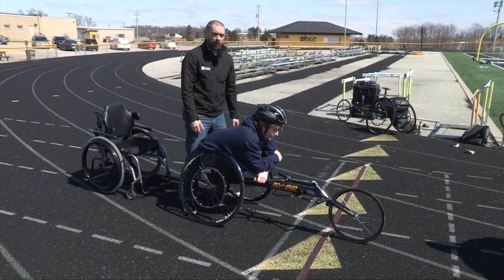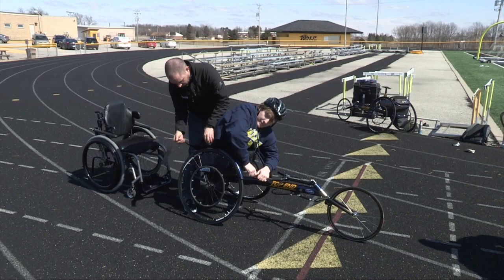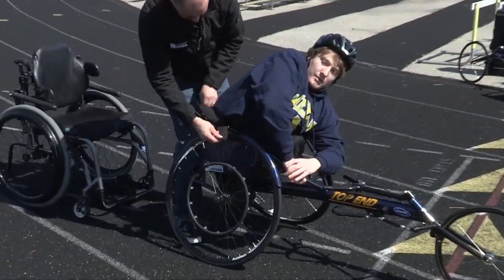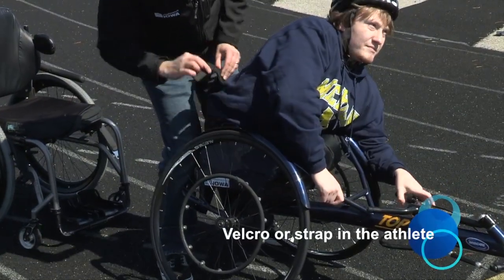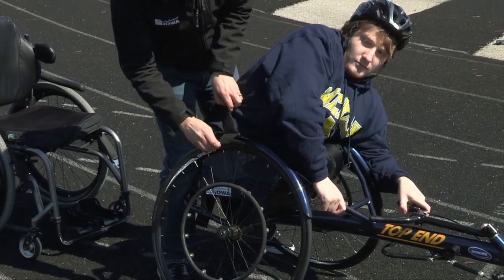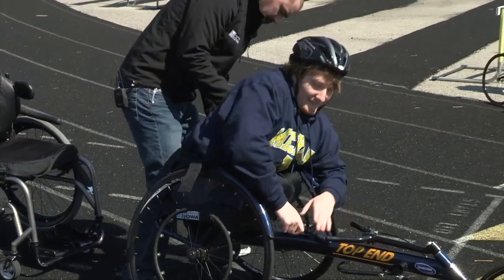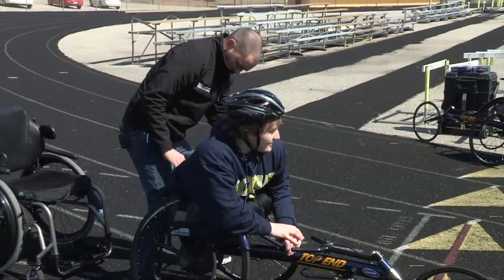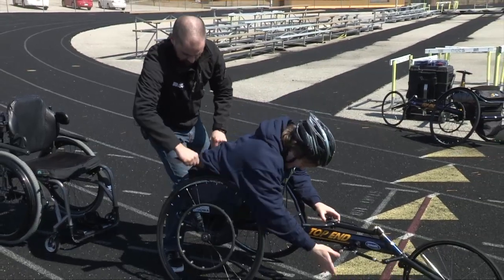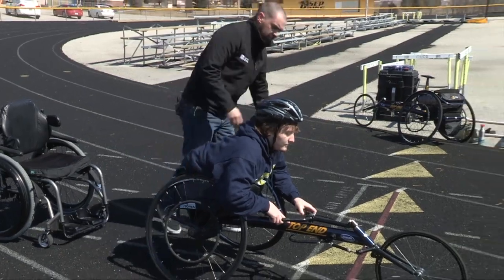That's why it's important to always have a helmet on whenever you're in the chair on the track. The last part here, sometimes these chairs have a ratcheting strap, or sometimes they're just Velcro like we have here. I want to bring him in nice and snug. Alright, you're all set and ready to go.